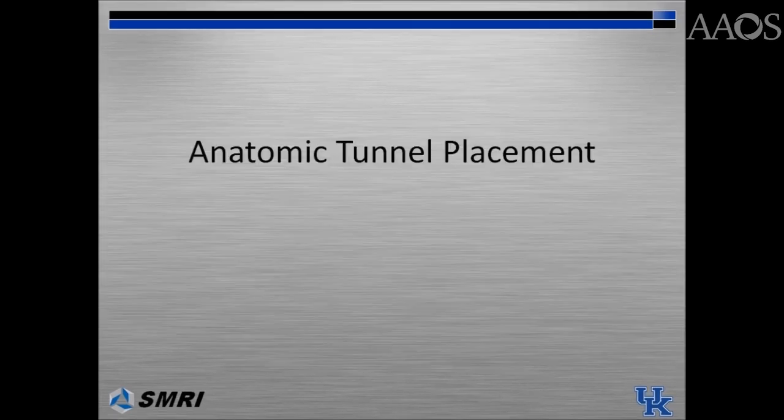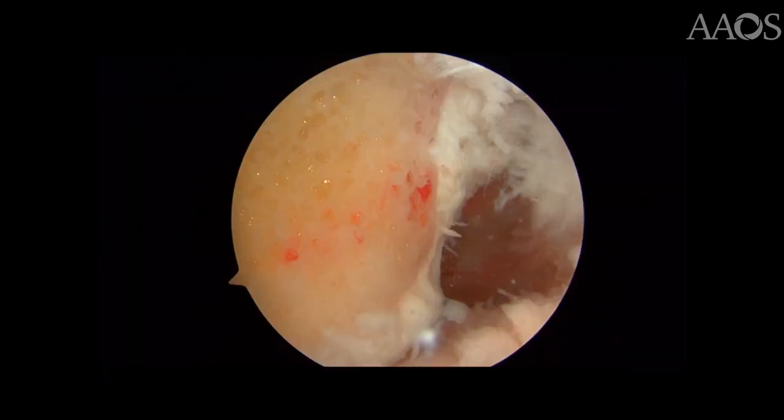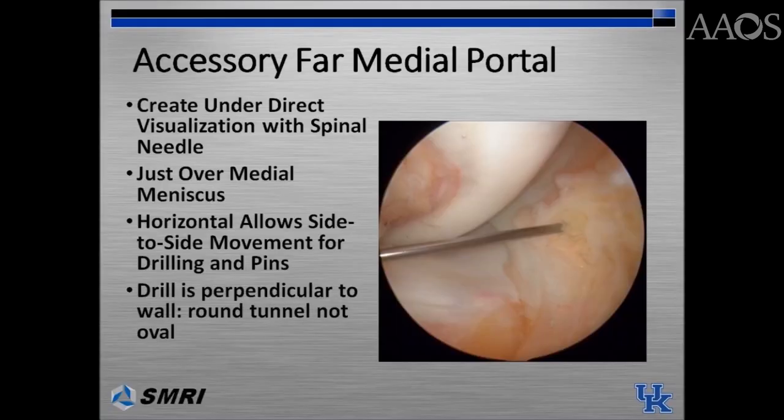Good visualization of the back wall is important in achieving anatomic femoral tunnel placement. For all inside femoral tunnel drilling, an accessory far-medial portal is created. It is important to create this portal under direct arthroscopic visualization with the aid of a spinal needle. This will ensure that the portal is medial and low, just above the anterior horn of the medial meniscus, avoiding iatrogenic injury to the medial meniscus.